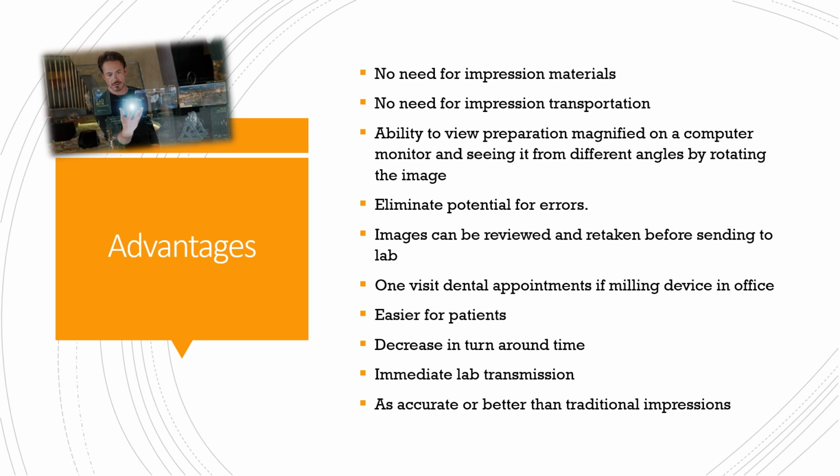One visit dental appointments. If there's a milling device in the office, it's easier for patients. It decreases the turnaround time for the lab because, again, they receive that scan pretty instantaneously or within like 3 minutes. Okay, so there's that immediate lab transmission, and it's more accurate than traditional impressions.